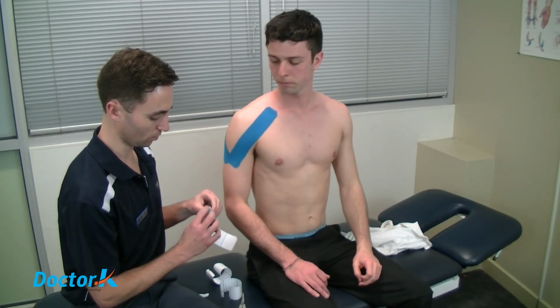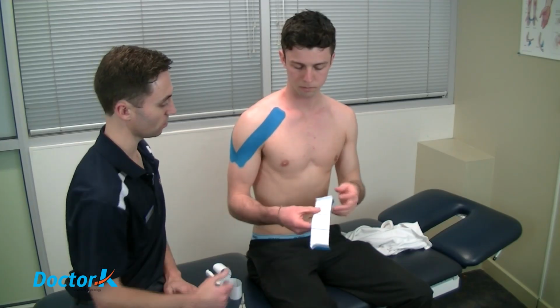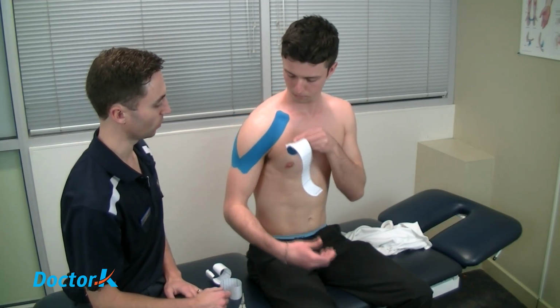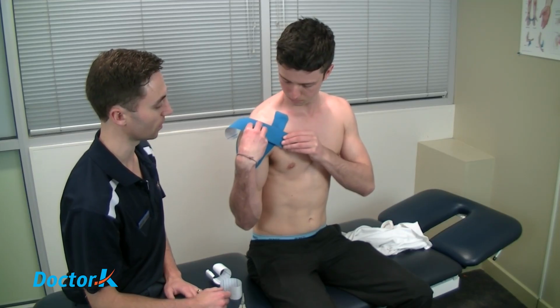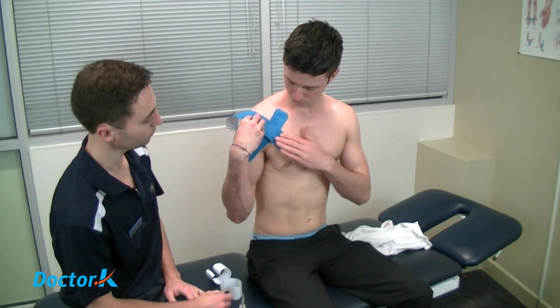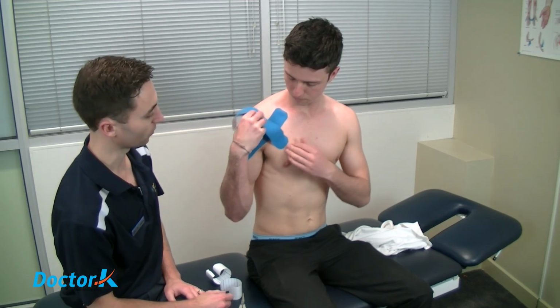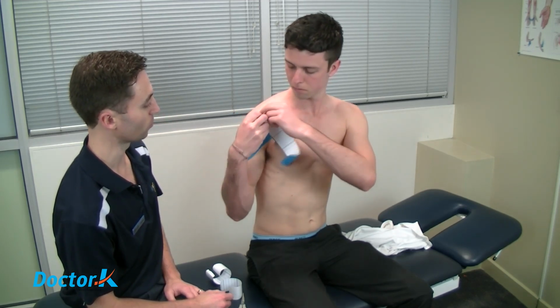So folding and tearing as we've done. And we're going to start this one on our chest. And we want to be careful that we don't pull too tight initially with this particular piece. We're just going to place it down, make sure the base piece is stuck on properly, and peel that tape back until you've exposed a reasonable portion of it.